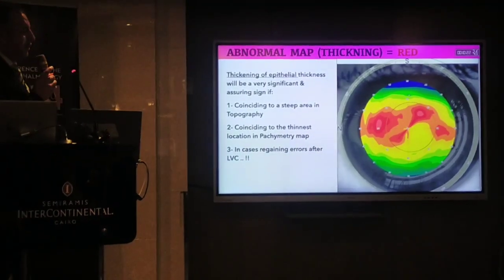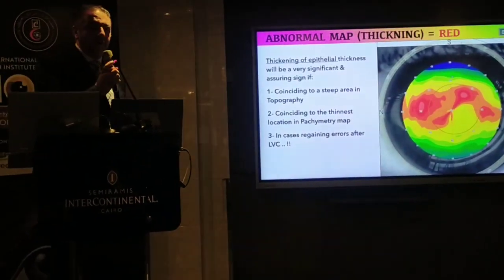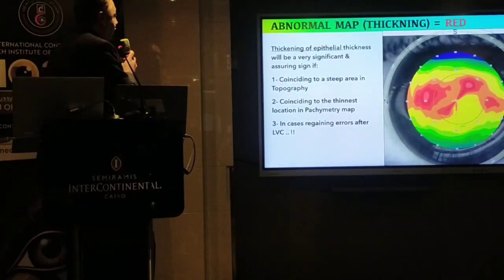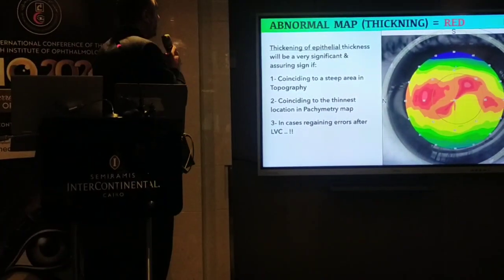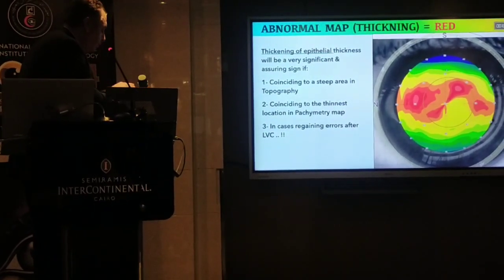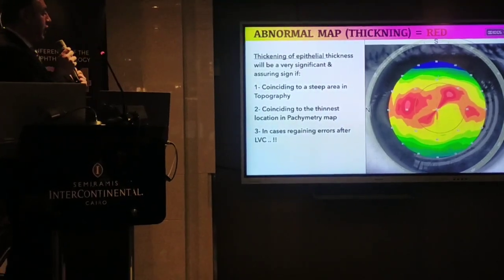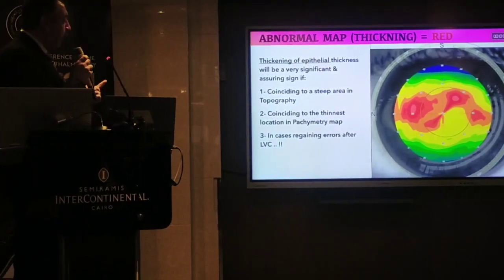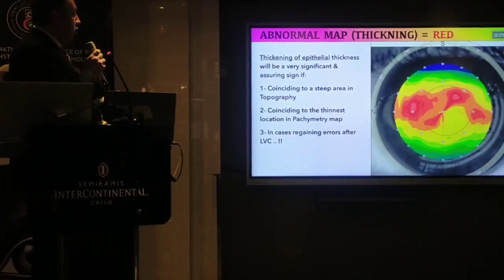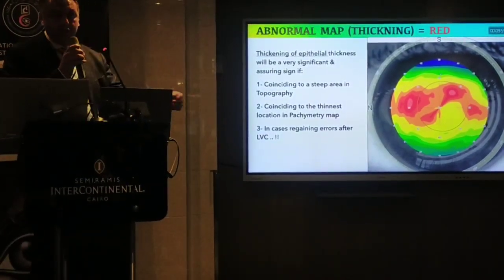This is a good sign. The spot is red, but it's a good sign — it shows thickening of the epithelium all over the steepening part. Thickening of the epithelial thickness will be very significant and an assuring sign if it coincides with a steep area in the topography and also with the thinnest location in the pachymetry map, and also in cases of refractive errors after laser vision correction, as I will show later.